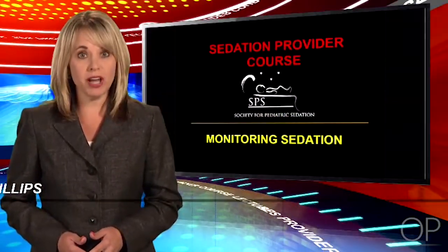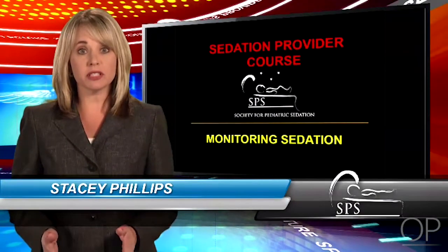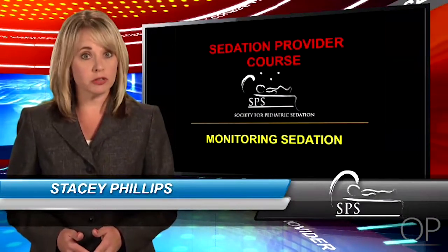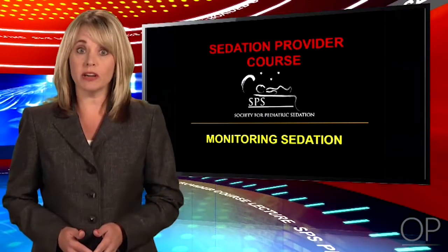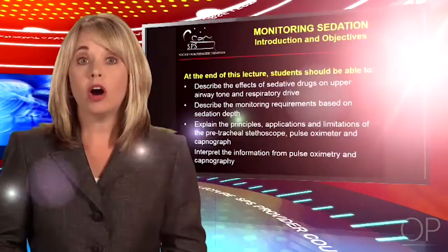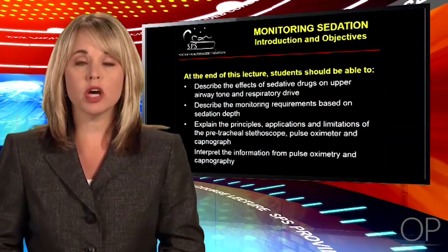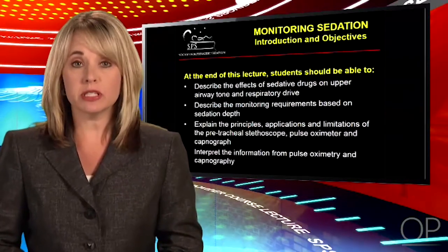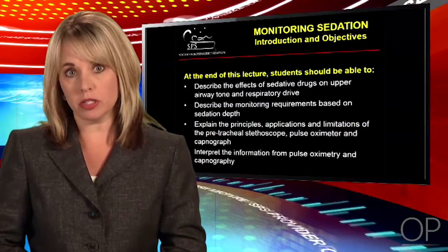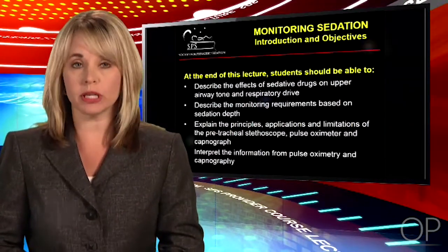Welcome to the Society for Pediatric Sedation's online provider course on appropriate sedation monitoring. Different levels of sedation require different monitoring strategies to ensure safety, and different procedures require different levels of sedation. Our goal in this lecture is to teach the knowledge base necessary to choose appropriate monitoring for each of these levels of sedation. Emphasis will be placed on respiratory monitoring, as most sedation-related adverse events are respiratory in nature.